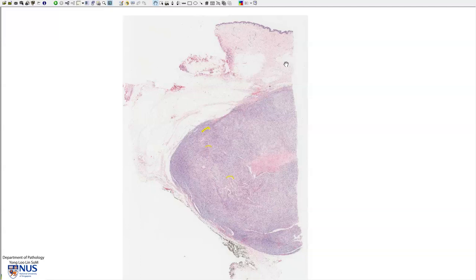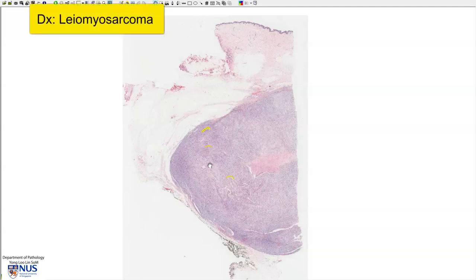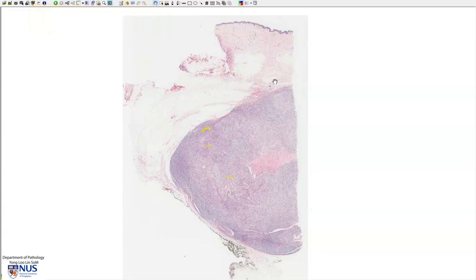This is a virtual microscopy slide of a leiomyosarcoma. This is a malignant tumor that shows smooth muscle differentiation. The benign counterpart is very commonly seen in the uterus and is known as leiomyoma. This leiomyosarcoma is arising from the soft tissue.